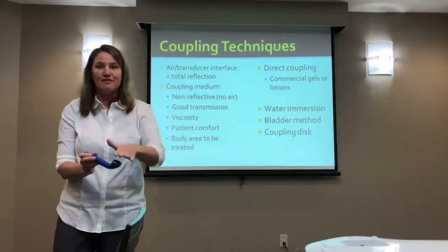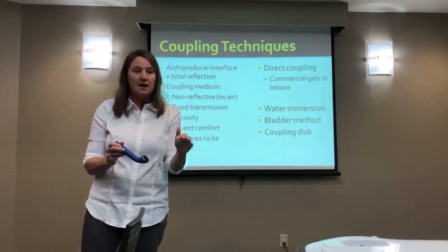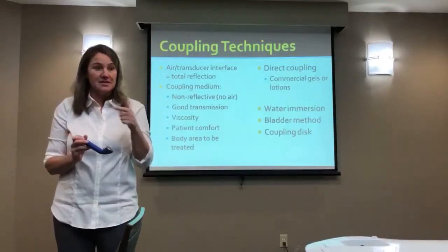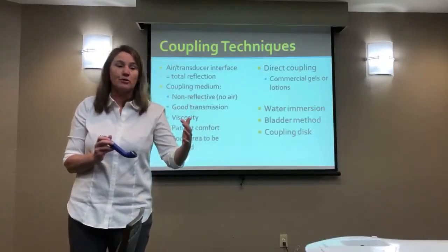And we stuck the glove in there, nothing came through. Now that was one particular type of glove, but it did not allow the ultrasound to even come through. So I said, just this glove, because this was at a private course at a facility, I wouldn't use these gloves because clearly the ultrasound's not even going through them anyway.